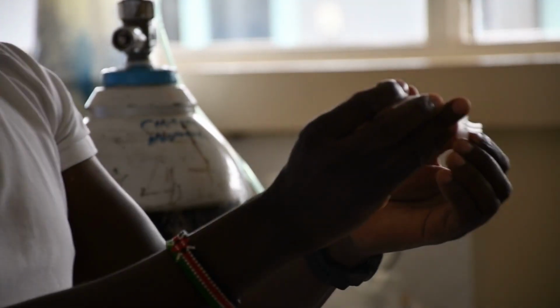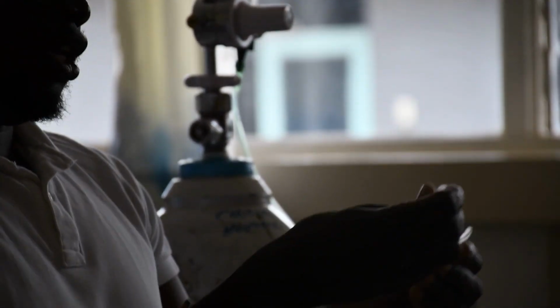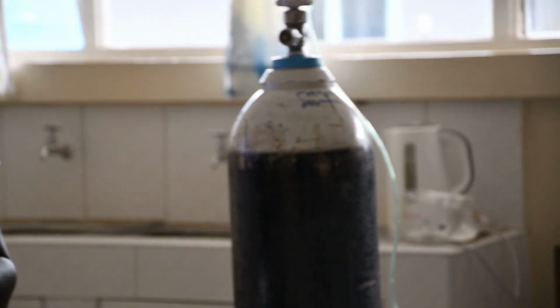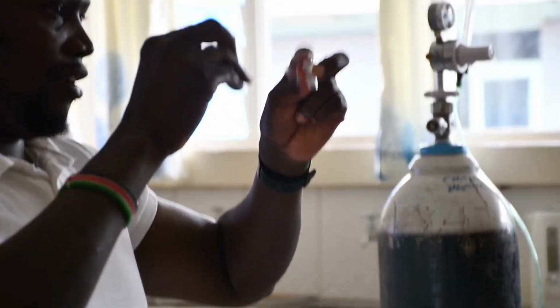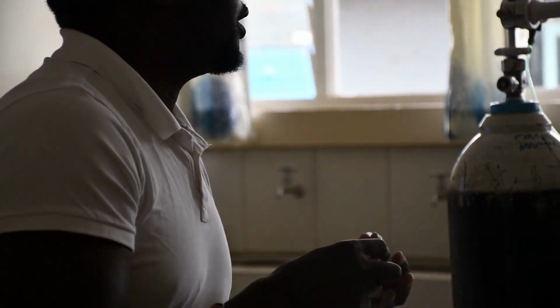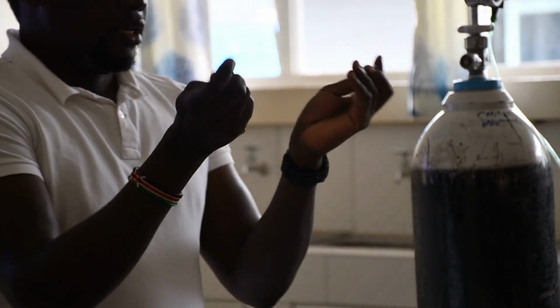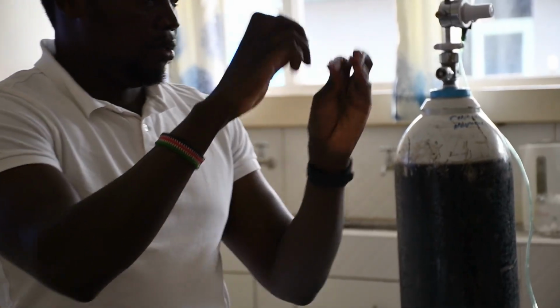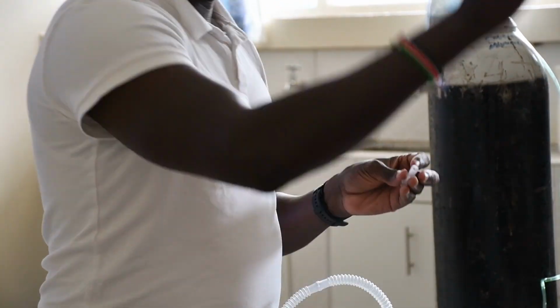Why we are separating it this way is because these are reusable, okay? So during the processing, we don't want it to be hard to process, okay? How do we assemble it? Please emphasize on this, because if you don't, then they're going to have a lot of problems with them, okay? How you want to assemble them? So just let's remove the elbows, okay? So we want to assemble this.